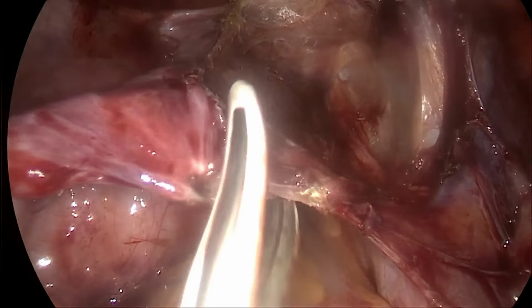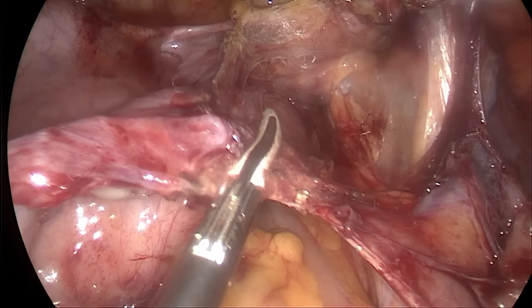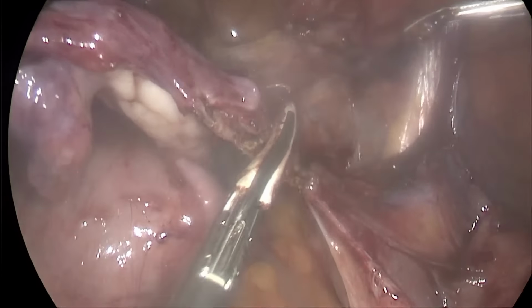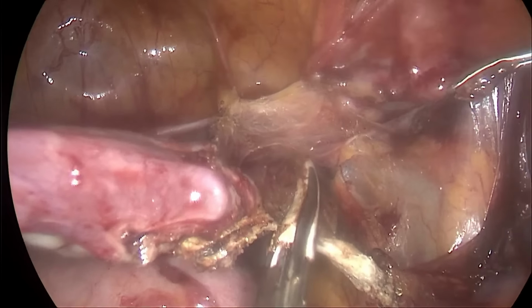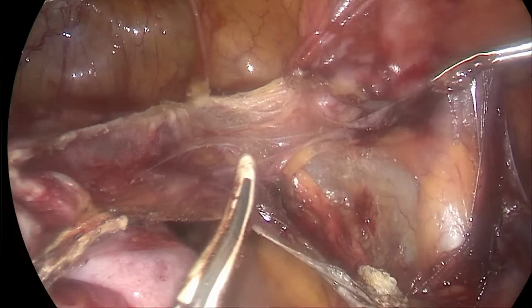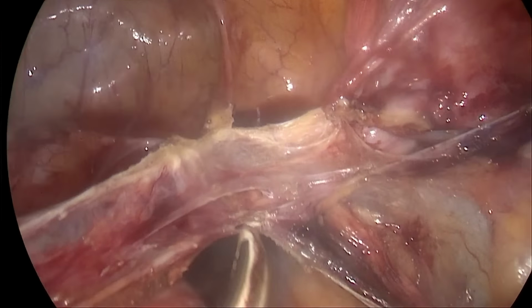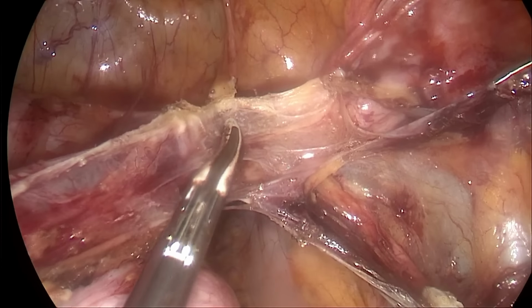So firstly, we are proceeding with the hysterectomy, opening up of the retroperitoneum, identifying the ureter. Then we are proceeding with the infundibulopelvic ligament of the right side. As on the imaging the cervix was not involved, we are not proceeding with the radical hysterectomy. So the hysterectomy in endometrial cancer is basically a type A hysterectomy as per the Querleu-Morrow classification.